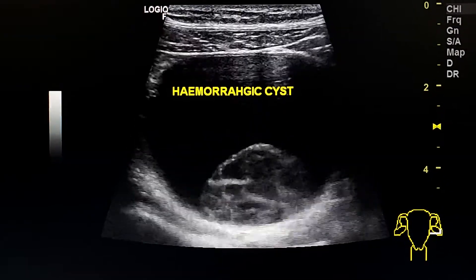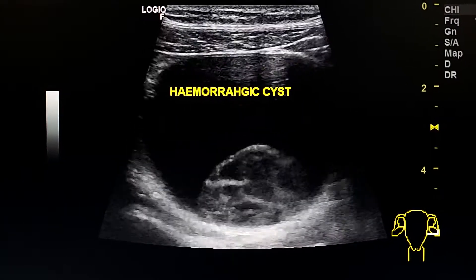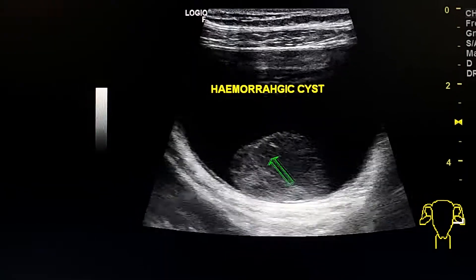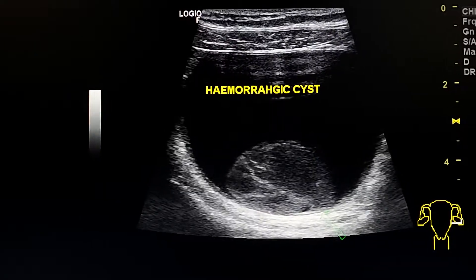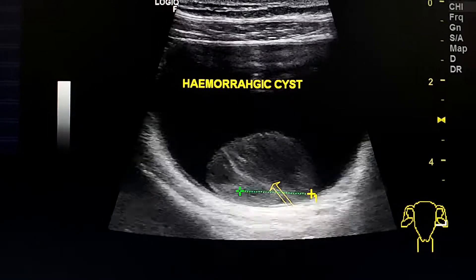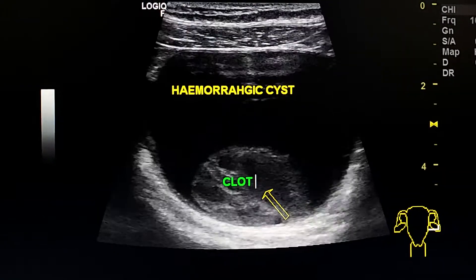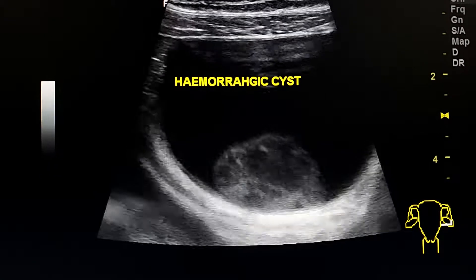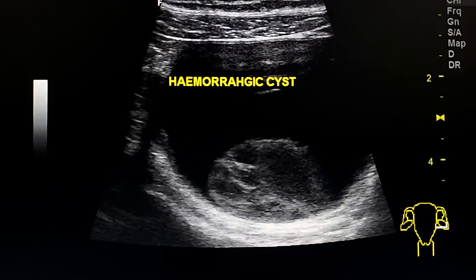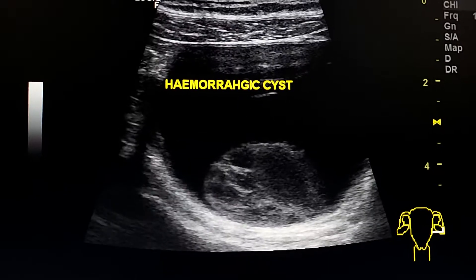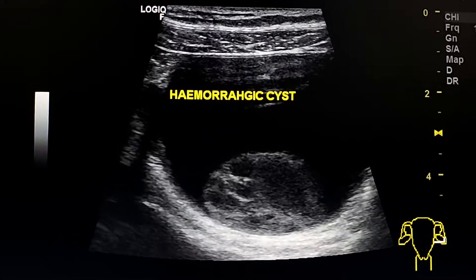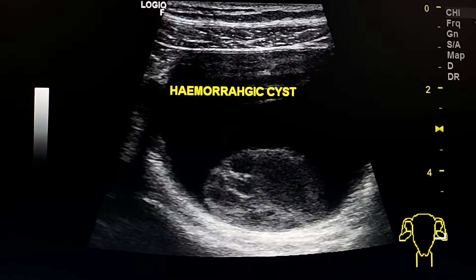This confirms that this is a clot and not a mural nodule. This is the clot retracted and adherent to the dependent wall of the cyst. The nodule moves like jelly by pushing on the cyst — this is not a feature of a tissue nodule. This confirms that this is a clot.